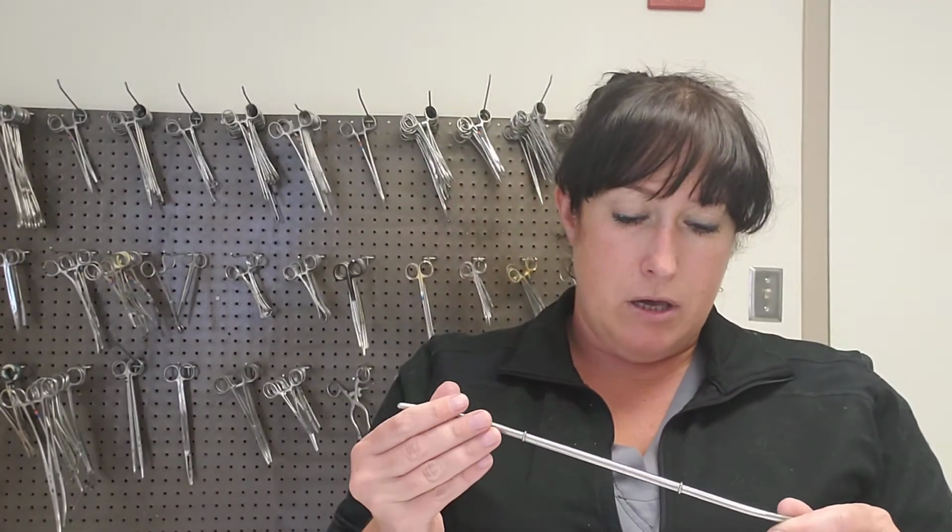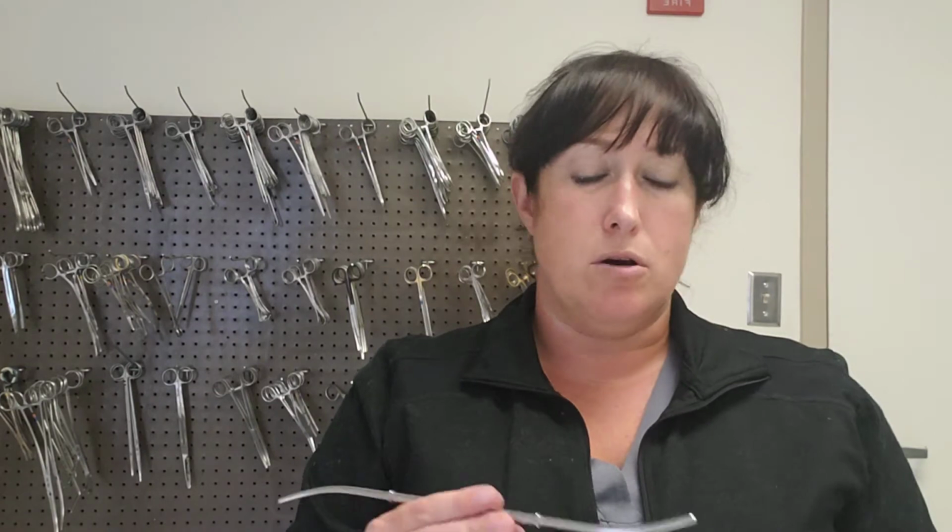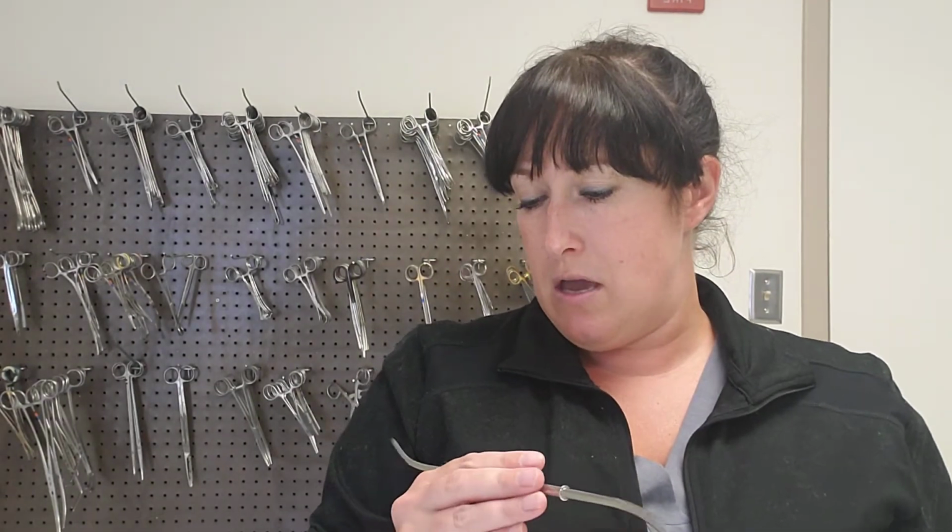And so always start with the smallest one, because they will come in a set of, I don't know how many are in there, but it's several. They'll come in a set of several of these dilating instruments, and you'll always start with the smallest unless otherwise advised by your surgeon. And what you will do is you will communicate with your surgeon what you're giving them. So the surgeon says, all right, give me an 11 dilator.